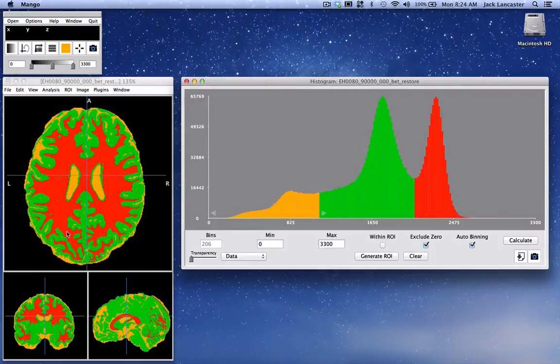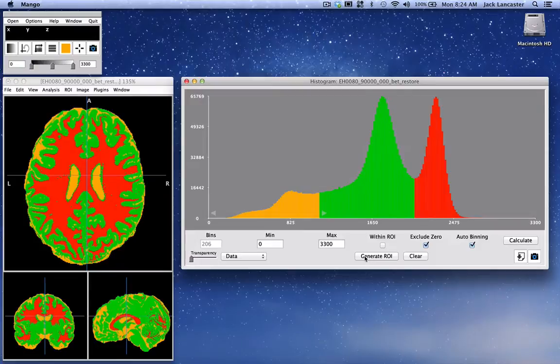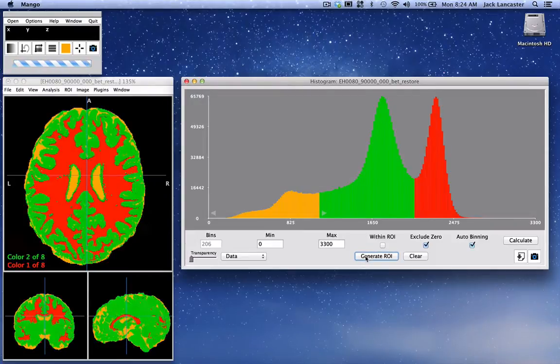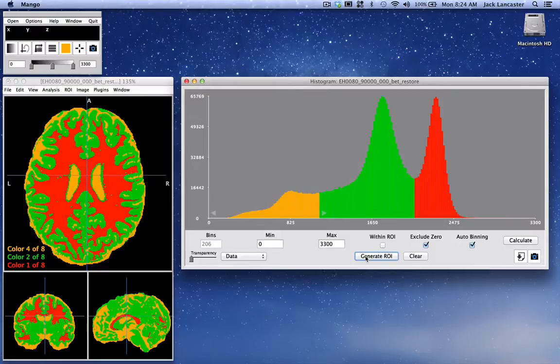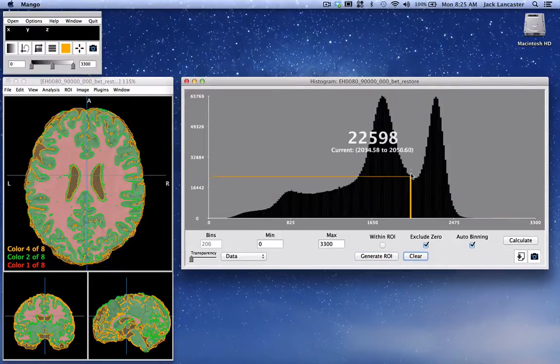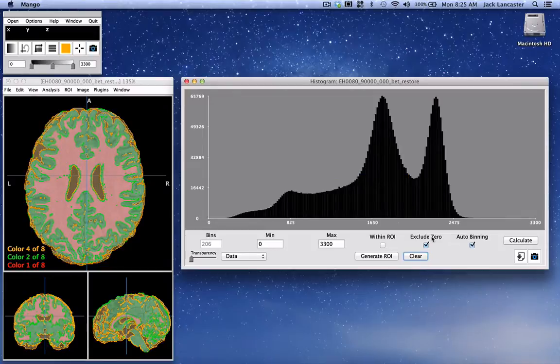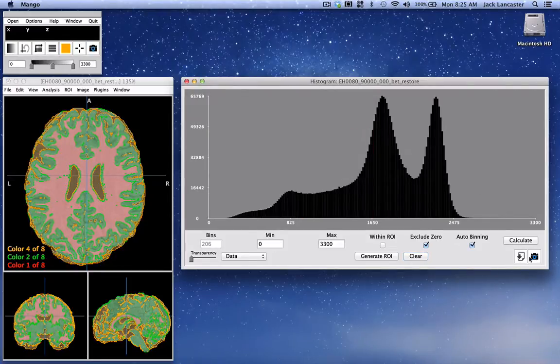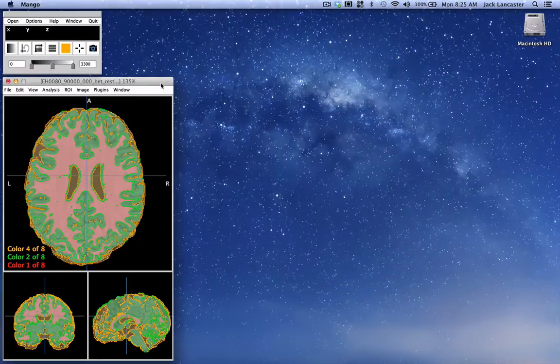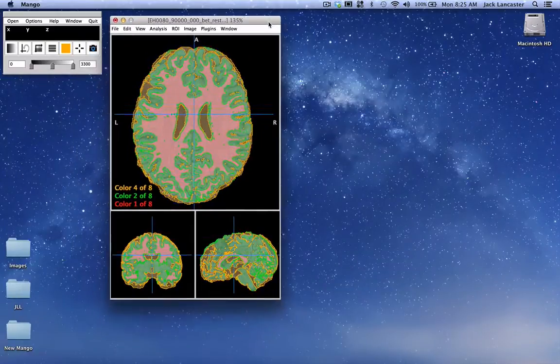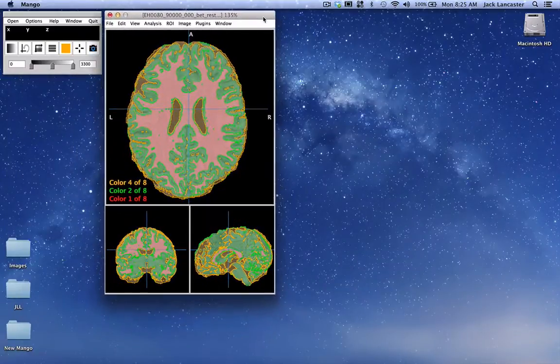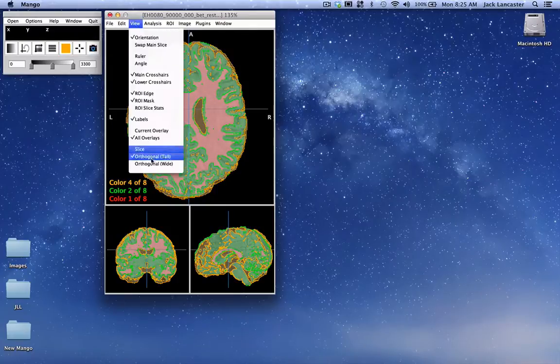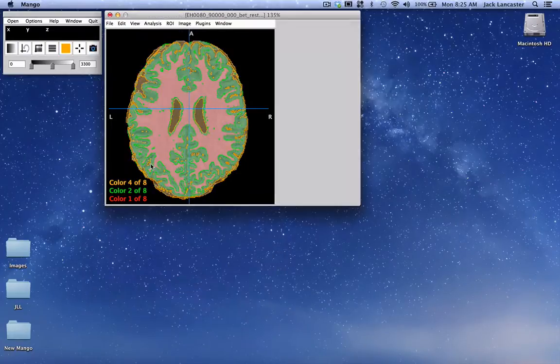You can see what we've highlighted in the ranges here. We've highlighted corresponding locations in the image and now we have a single generate ROI button. If I click it, it's generating the red, the green, and the gold. We can clear everything off here. If you like this histogram and want to save it for some reason, we used to have a text save, now we've changed it to an icon so it's still there.